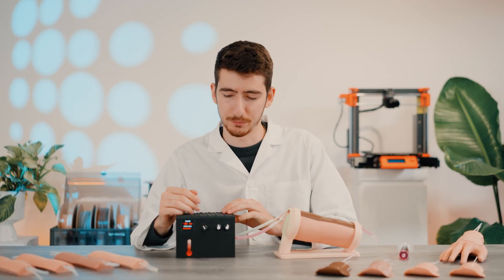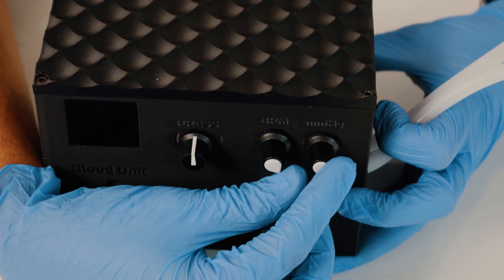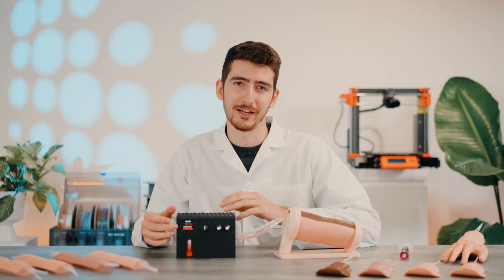This unit has three control knobs: one for controlling the user interface, one for controlling the blood pressure, and one for pulse rate. The OLED screen shows you the current settings.